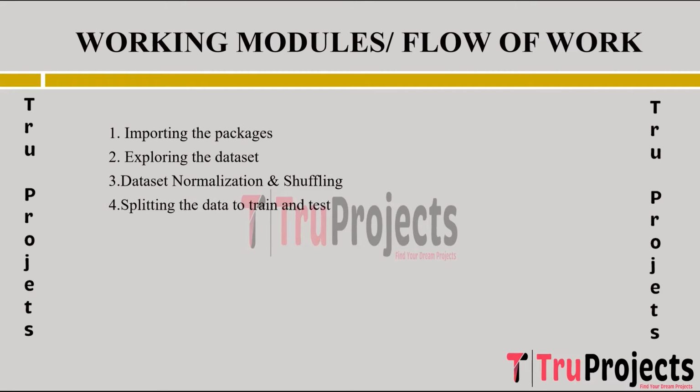Splitting the data to train and test. Dividing the dataset into two subsets, the training set and the test set. The training set is used to train the machine learning model, while the test set evaluates its performance and generalizability.